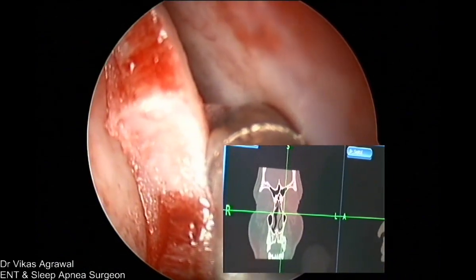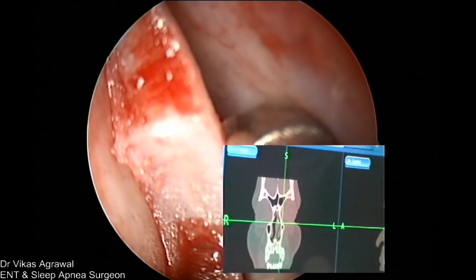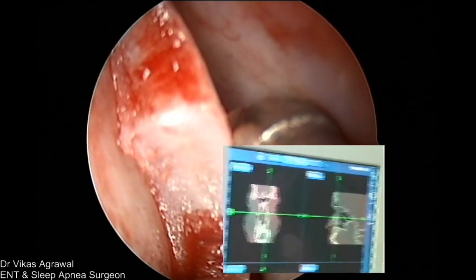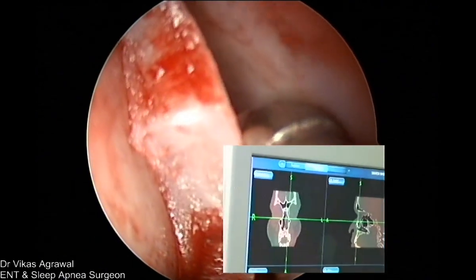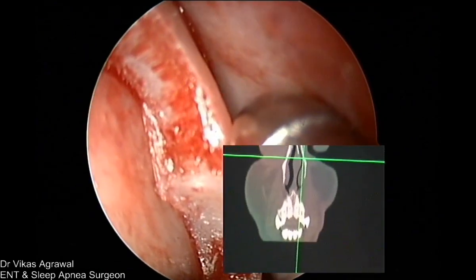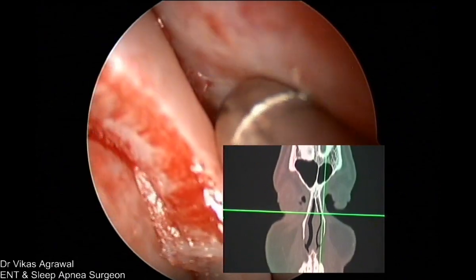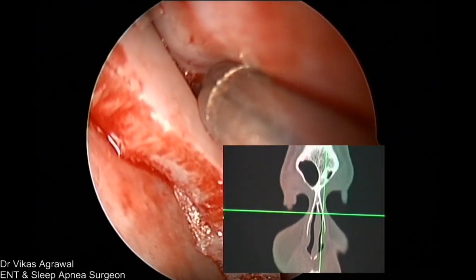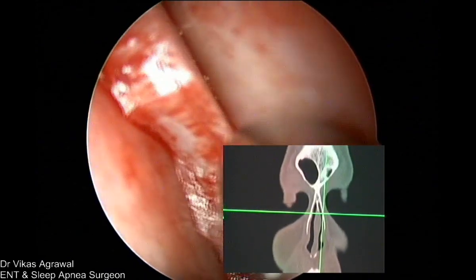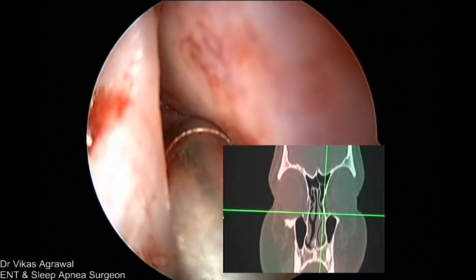No, coronal. Now see, Shravan, you do the whole thing. Let Shravan do it. Okay, now see, this is the bone. Where do we stand? It's so low, right? It's below the frontal sinus. Can you see that? I'm tracing it up. It's below the frontal sinus. There's no skull base around. So now as you go behind, see, this is still the frontal sinus.